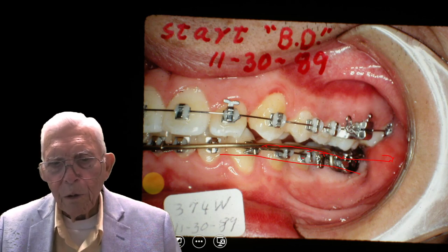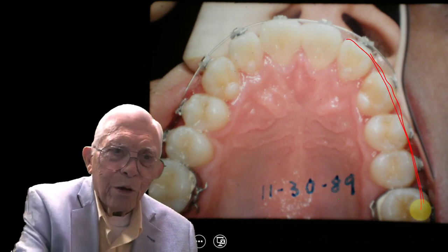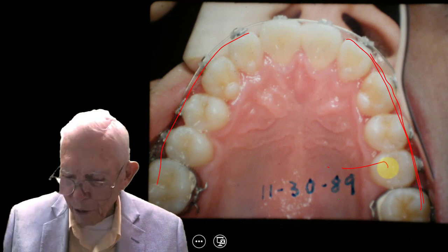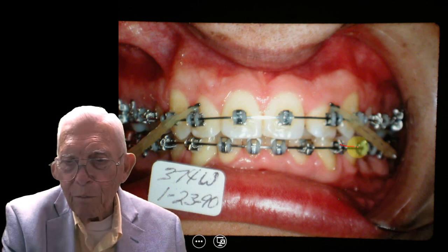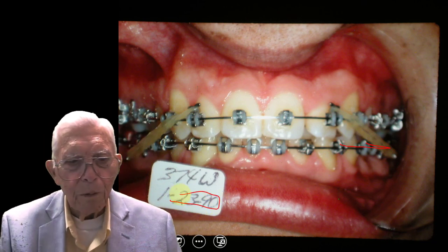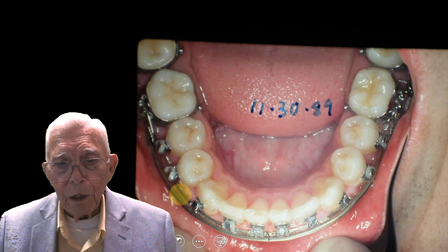After wearing those elastics, the cuspids are lined up now. But these teeth are out further than they were, which means the lower teeth have to go even further to compensate. We've lined the upper arch up and now the lower teeth are binding together over here. This is January of 1990 and we started this sometime in 1989. We had that part corrected.